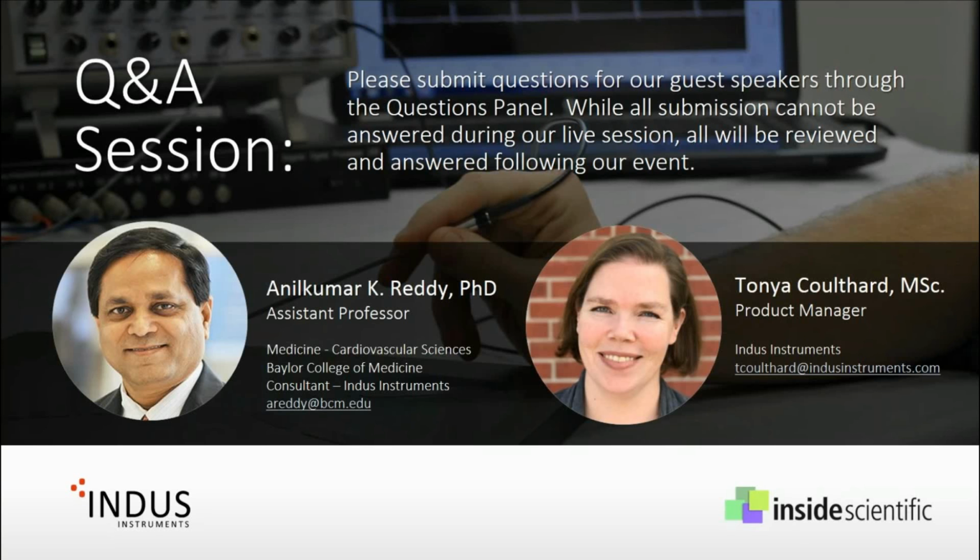So basically we're looking at the stenotic jet velocities that we've seen go as high as 6 to 7 meters per second. Our system is capable of going up to 9. So that's where we switch from a 20 to a 10.